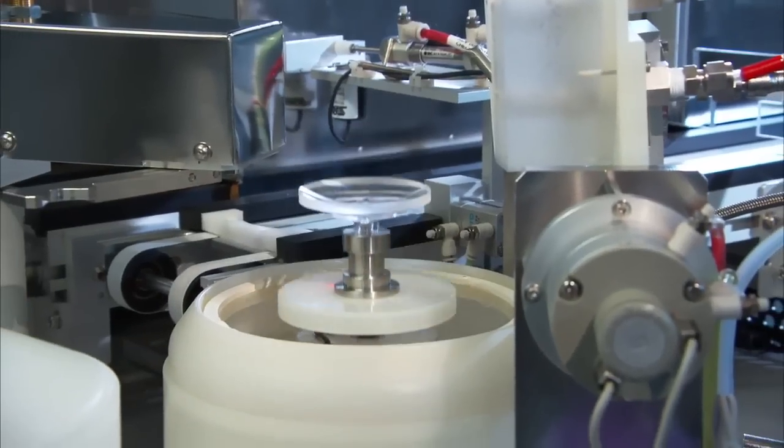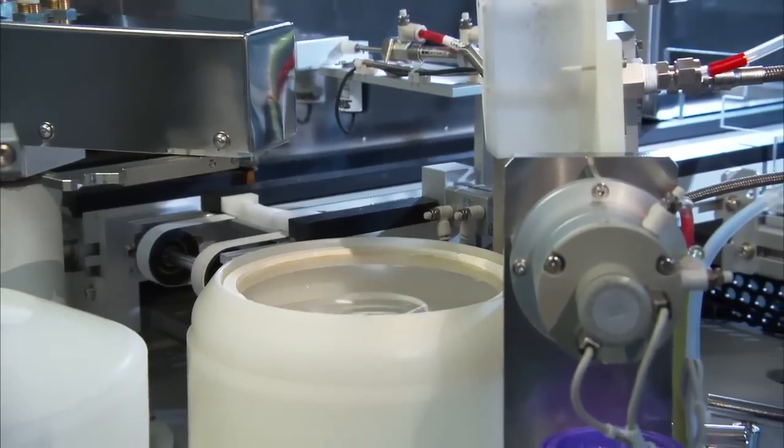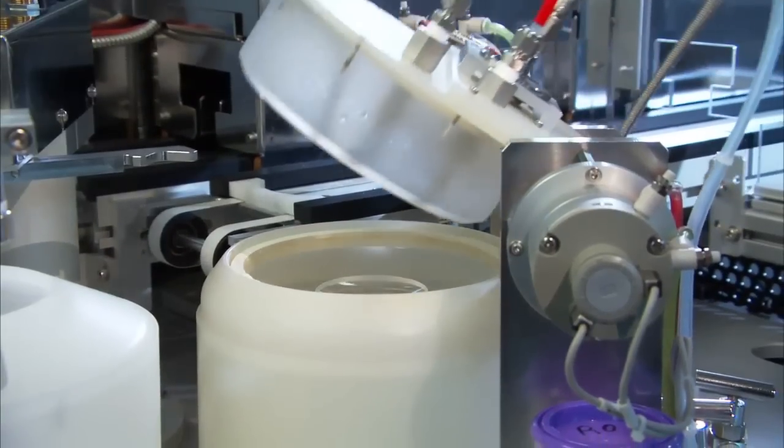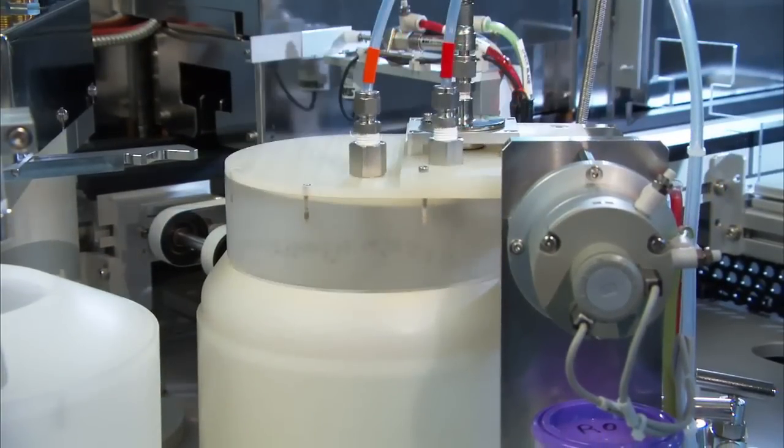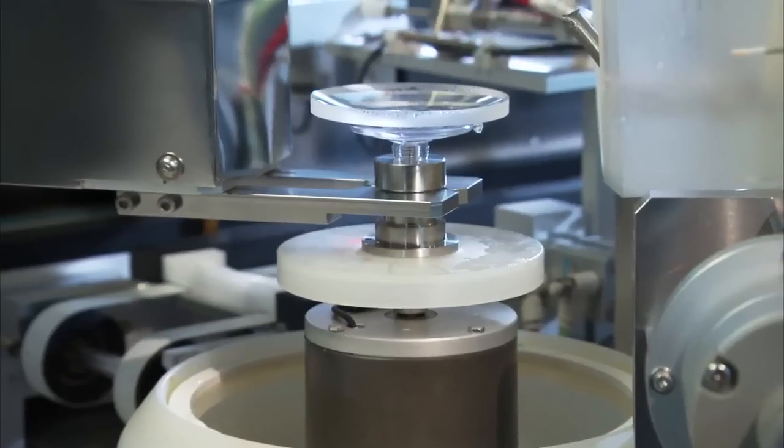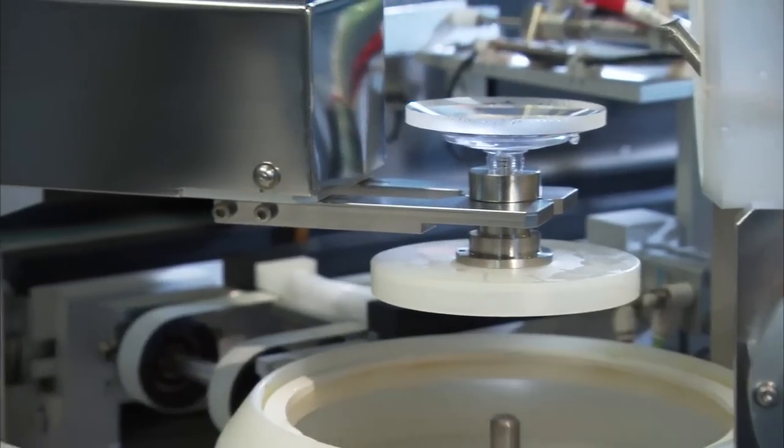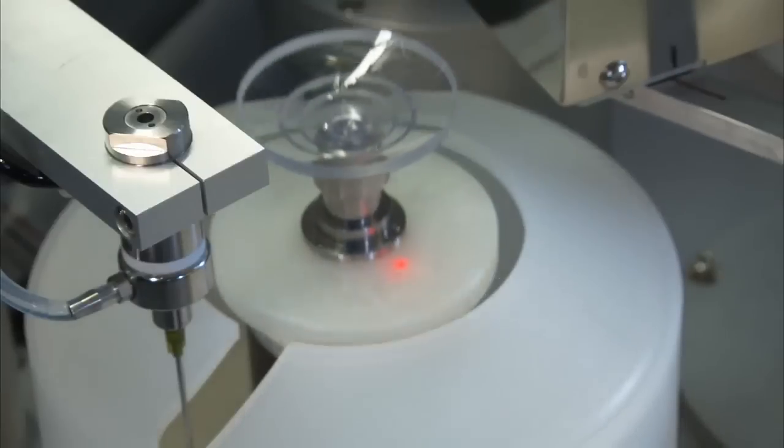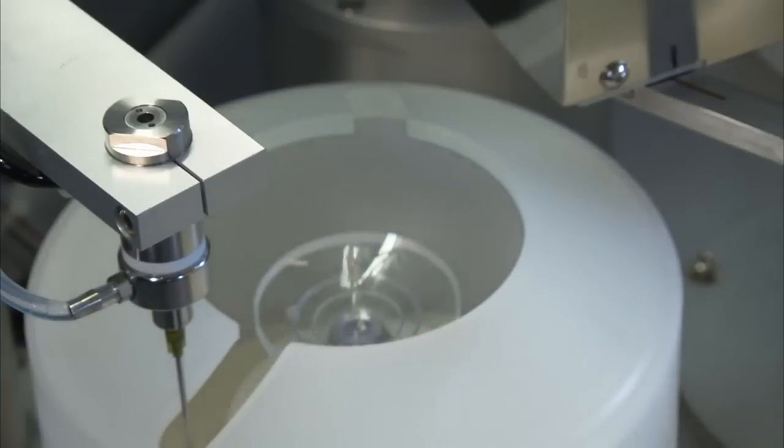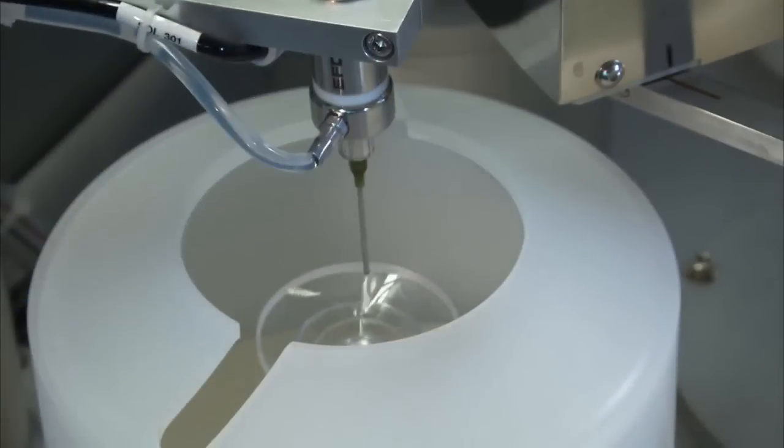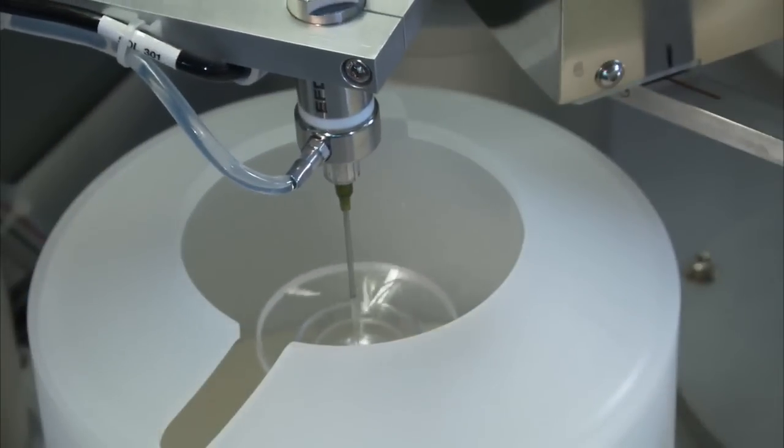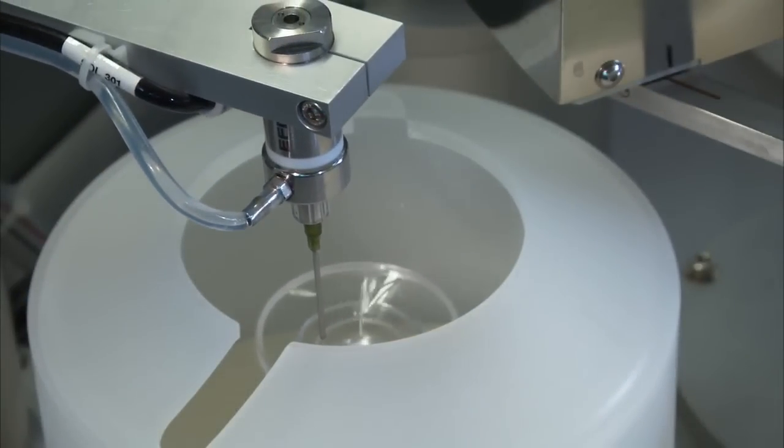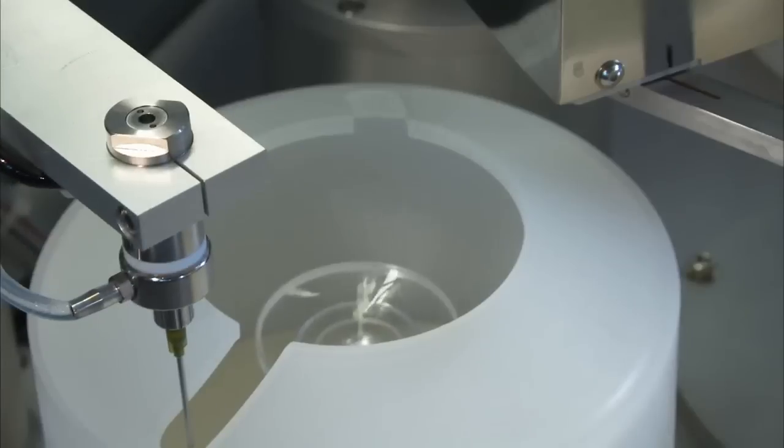When the lens first enters the SBSM, it goes through a high-pressure cleaning cycle. After that cleaning, the lens has the first layer of coating applied, which is a latex layer that expands and contracts with the lens and the applied scratch coat layer.